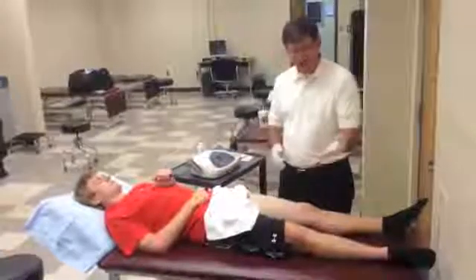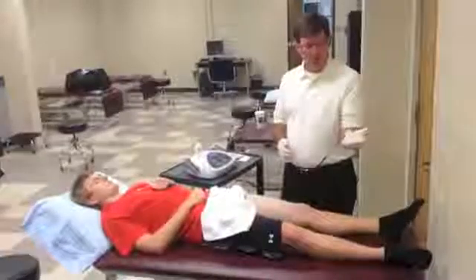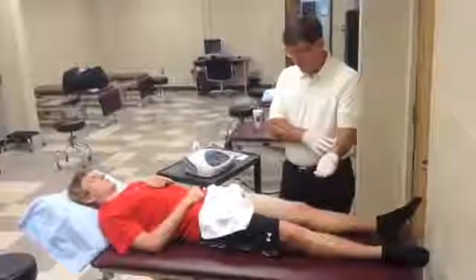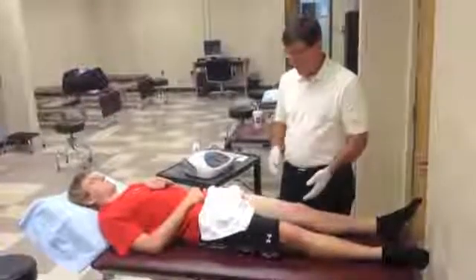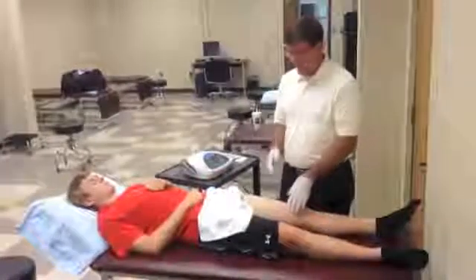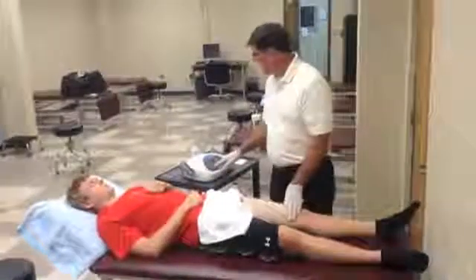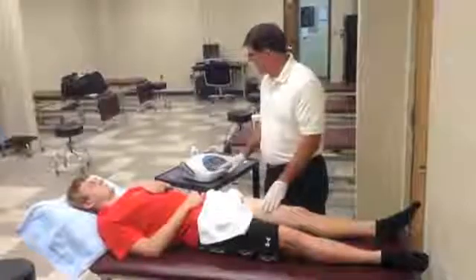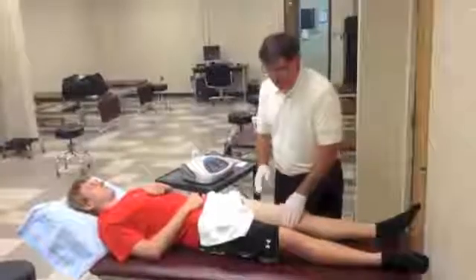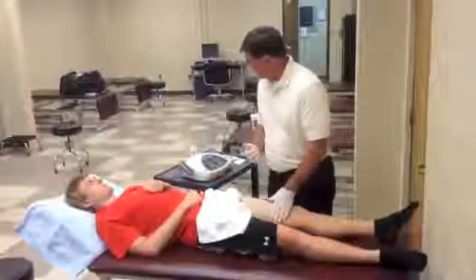The patient is holding a ground mass and I'm connected to the circuit through this electrode on my arm, but I'm wearing non-conductive gloves. What we're going to do is bring the two circuits close together, and as we do, they're alternating very rapidly.